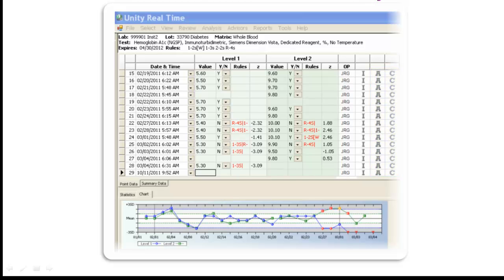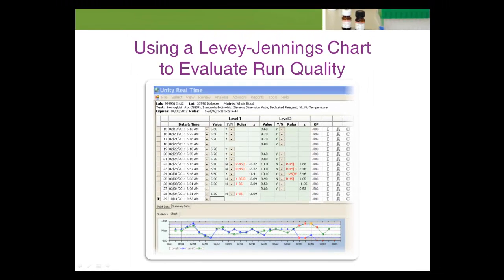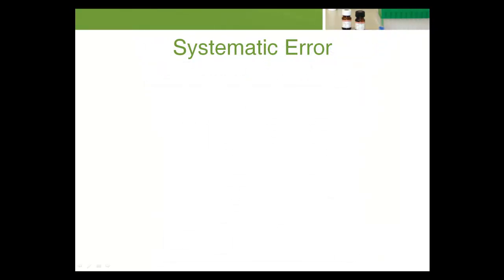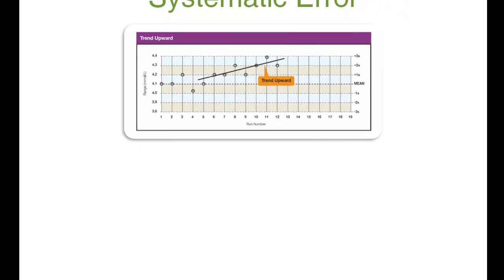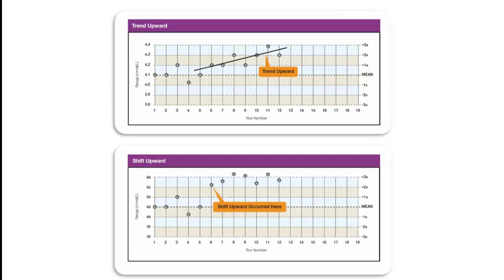Once the QC results are entered into the QC log, they should be plotted on the Levy-Jennings chart. When the results are plotted, an assessment can be made about the quality of the run. The technologist or technician performing the test should look for systematic error and random error. Systematic error is evidenced by a change in the mean of the control values. The change in the mean may be gradual and demonstrated as a trend, or it may be abrupt and demonstrated as a shift in control values.